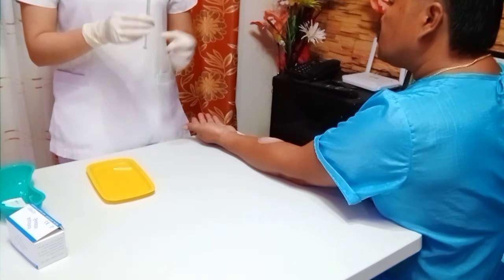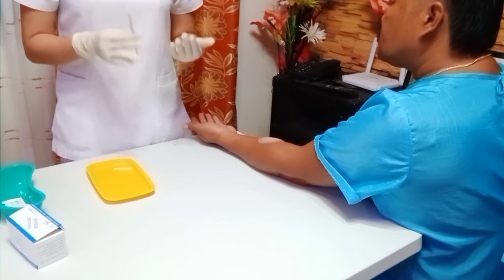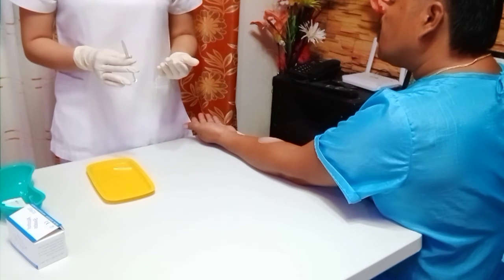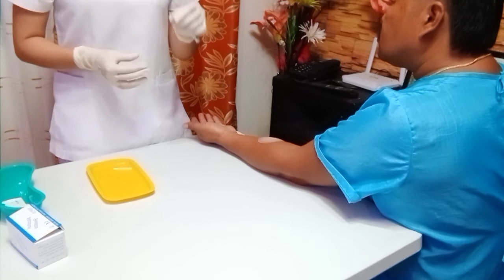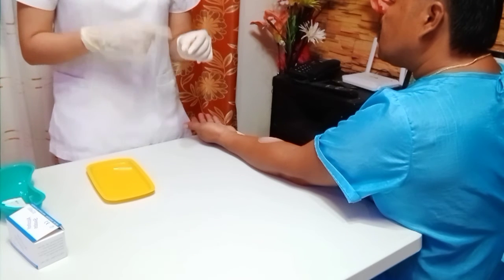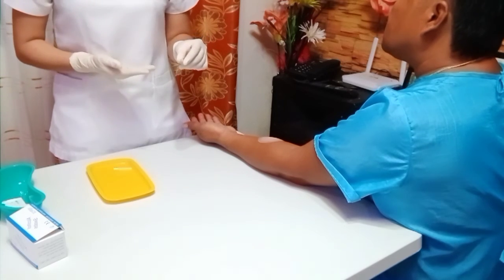Next is to expel air bubbles from the syringe, since air in larger amounts can act as an air embolism, which is dangerous to the client. Next is to grasp the syringe close to the hub, holding it with your thumb and forefinger. This will prevent accidental loss of medication.